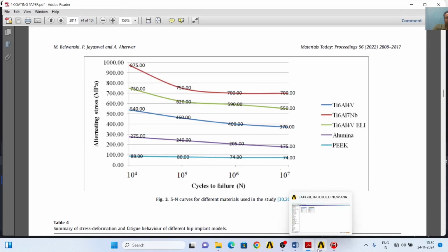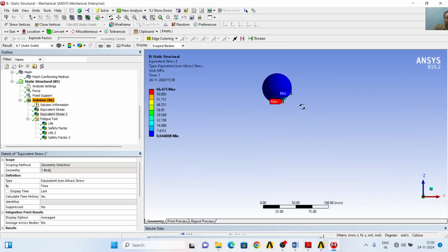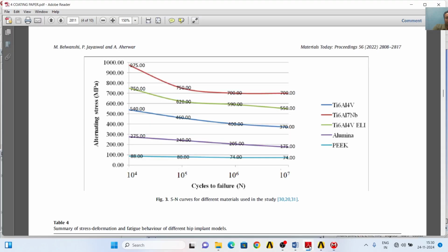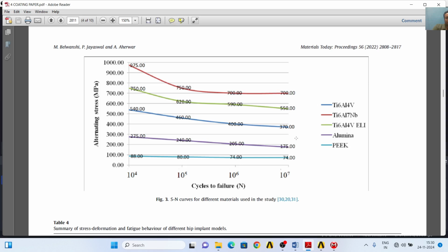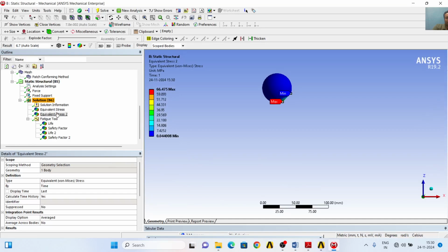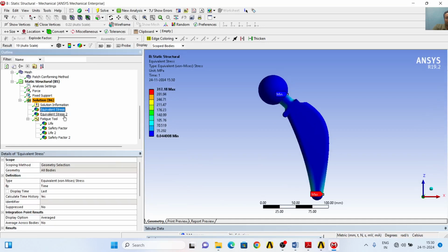So we can conclude that the head is going to survive 10 to the power 7 life cycles on the basis of this S-N data curve for alumina, as the stresses are only 66.475 megapascal and the stresses for 10 to the power 7 life cycles should be less than 175. That is all right. So the alumina head is going to survive 10 to the power 7 life cycles for sure. Okay, and now the equivalent stresses for the whole body, which means the maximum is here.